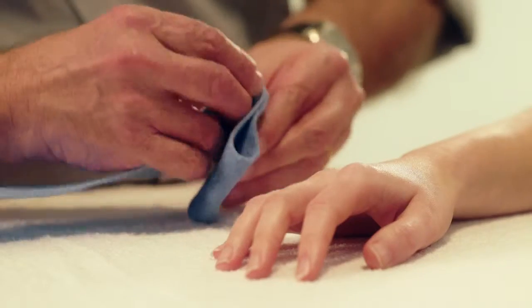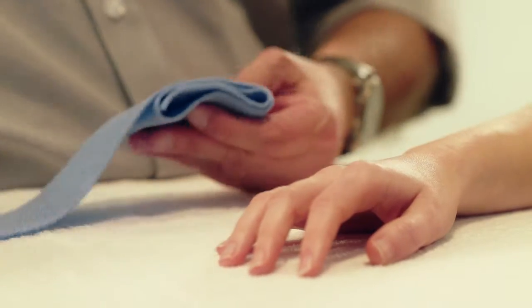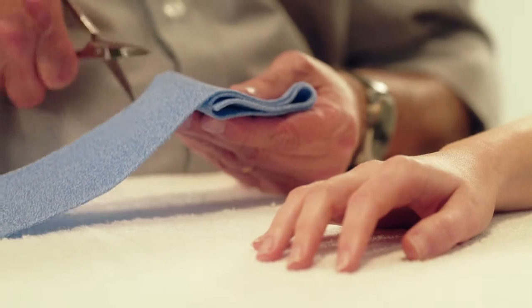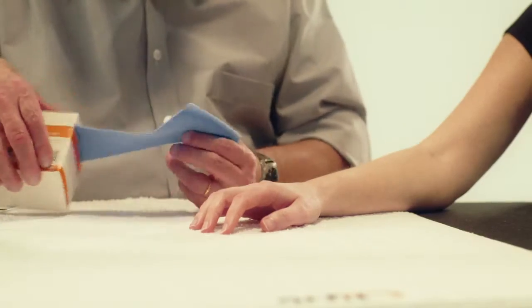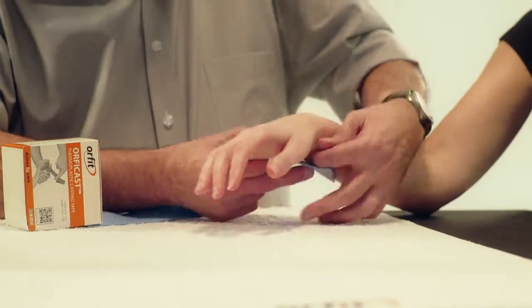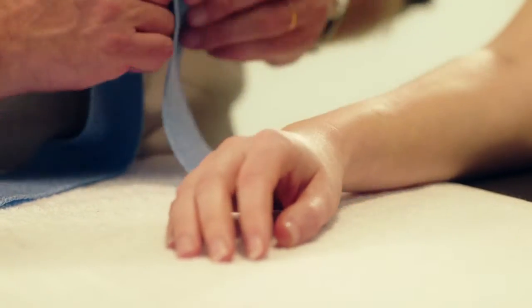Take the first strip of Orficast 6 cm wide. Measure 4 times the width of the hands at the level of the MCP joints and cut it accordingly. Take a second strip of Orficast 6 cm wide. Measure 2 times the circumference of the wrist and cut it accordingly as well.